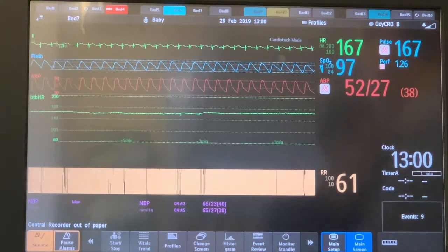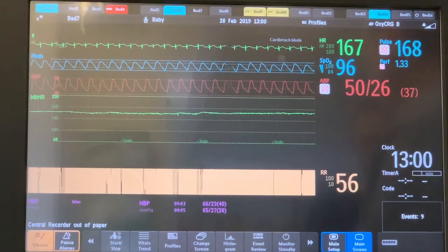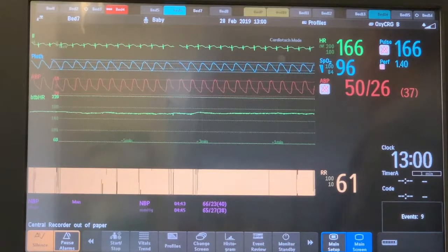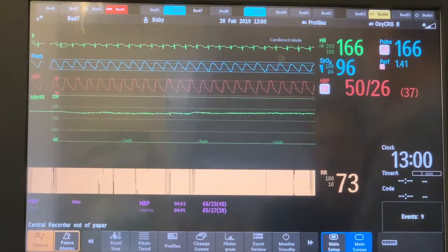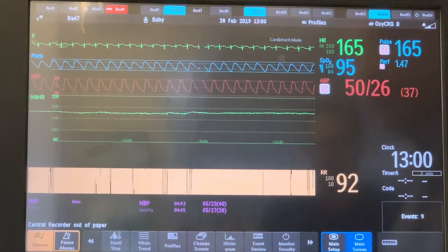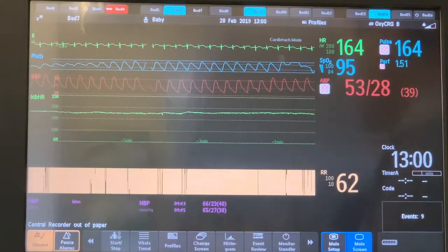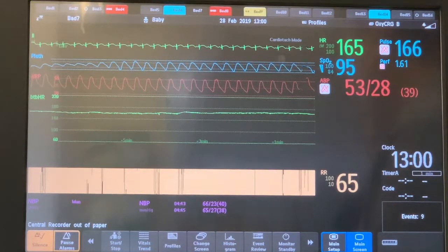I will be talking about monitoring of hemodynamics and the vital signs at the bedside. We have multiple ways of reporting vital signs at the bedside. The usual way, which is I believe the least helpful, is to report the vital signs on regular intervals. But I will present now, with the monitor on at the bedside, how to report the vital signs in a more objective way and how to get reasonable pathophysiologic information from the vital signs.